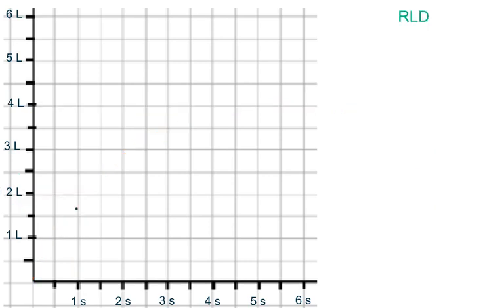On the other hand, in restrictive lung disease, the curve is like this. Remember, here the airways are normal, so the patient will blow out normally, but due to the restriction in the parenchyma, the lungs cannot expand normally. So the overall capacity of the lungs is reduced, which means that both the FVC and FEV1 will be reduced.